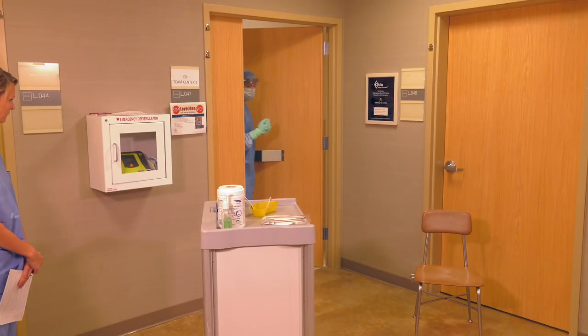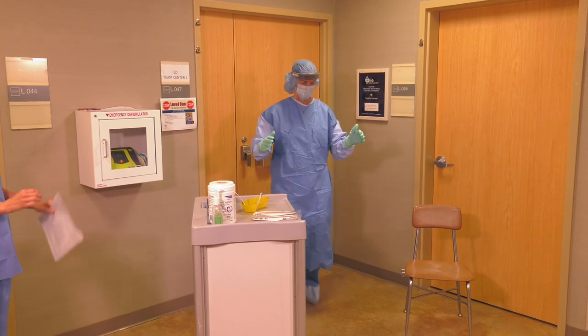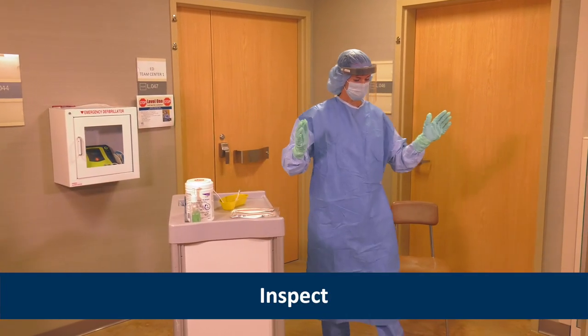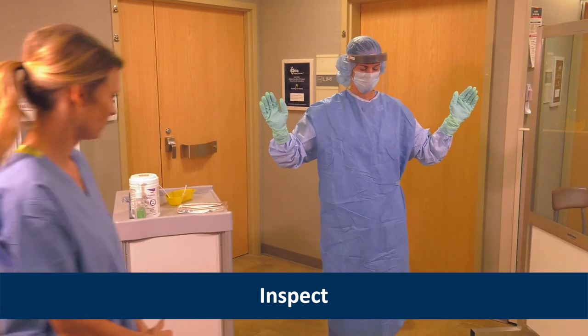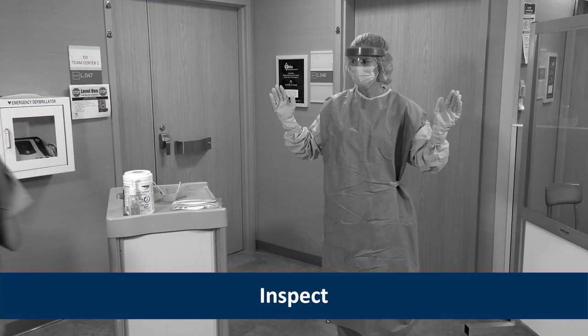As Heather exits the room, she knows her PPE is contaminated. Angie, the trained observer, helps her visually inspect the PPE to assess for visible contamination, cuts, or tears before starting to remove it. If PPE is visibly contaminated, Heather would clean and disinfect it using an EPA-registered disinfectant wipe.